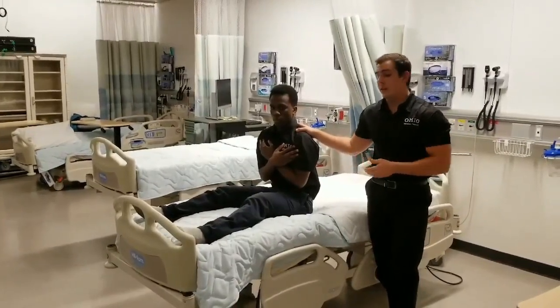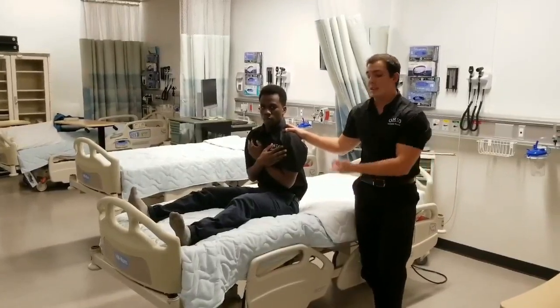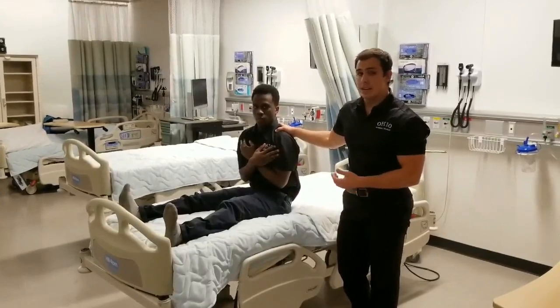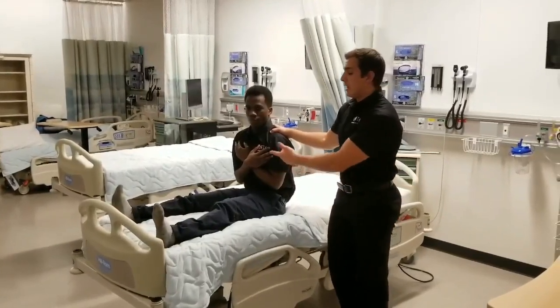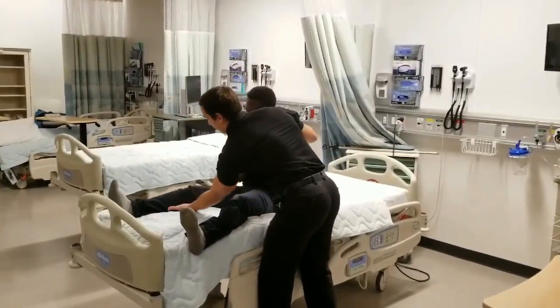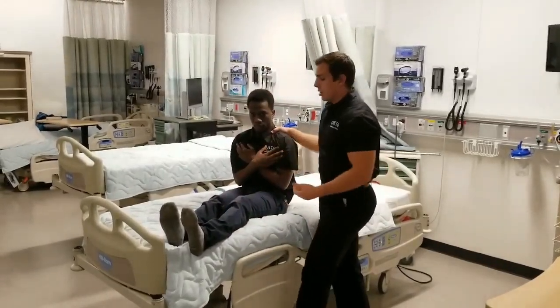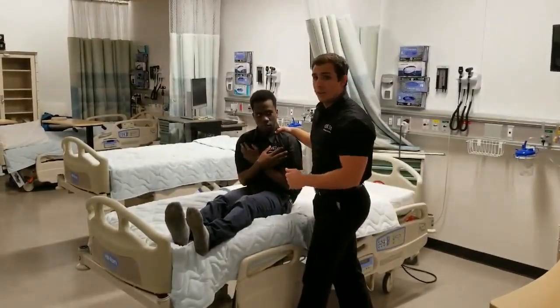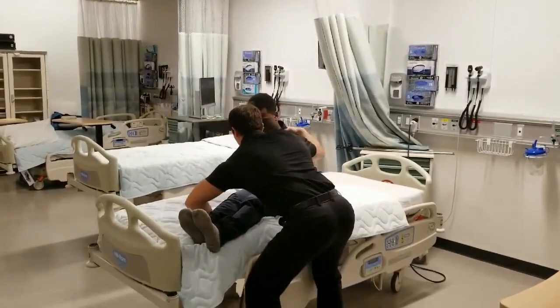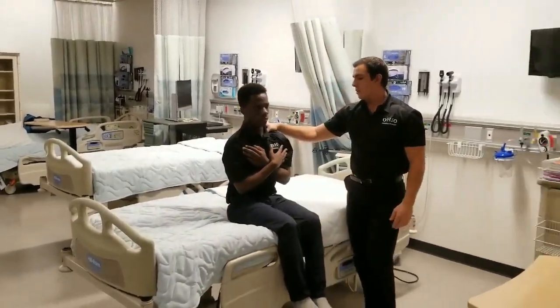In this position, the patient is currently in a long sitting position with the hips flexed at 90 degrees and the knees fully extended at the edge of the bed. So in order to pivot the patient to sitting at the edge of the bed, you're going to want to abduct and adduct the legs close to the edge of the bed to get in a good position. You'll want to then reach across the legs of the patient just under the knees and below the level of the kneecaps. Now I'm going to twist you in 3, 2, 1. Still maintaining contact with the patient.